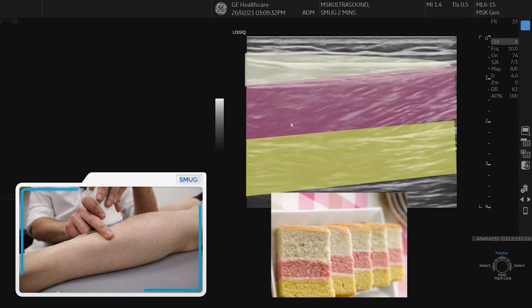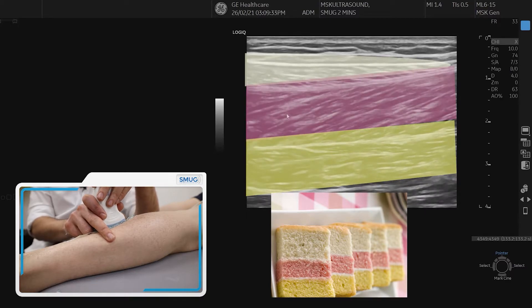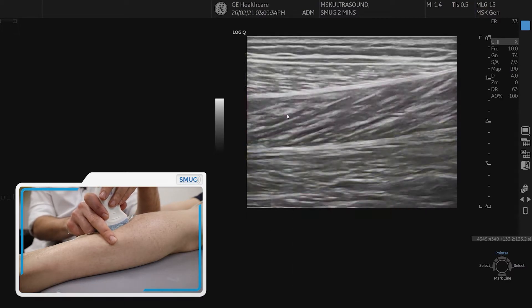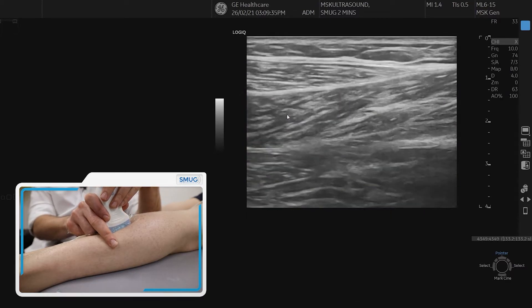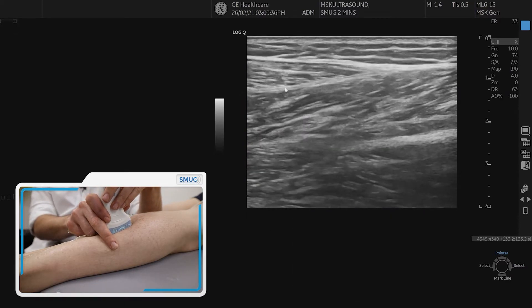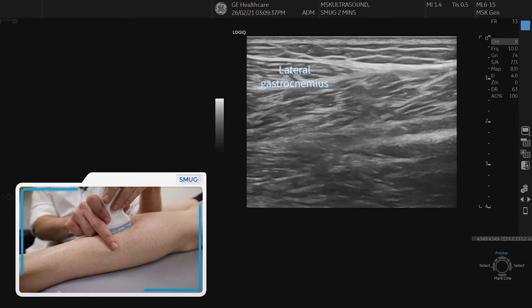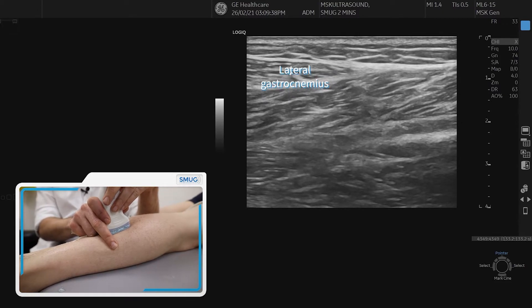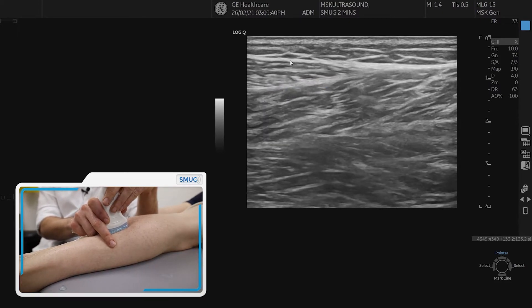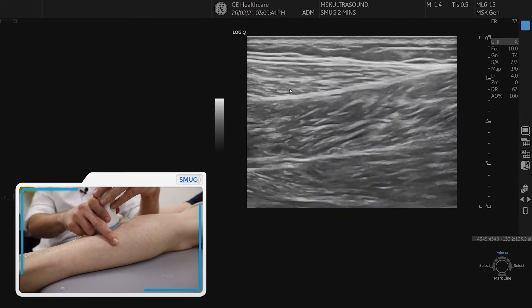Moving laterally, we have exactly the same layers, but now we are on the lateral gastrocnemius, which can be followed up and down.